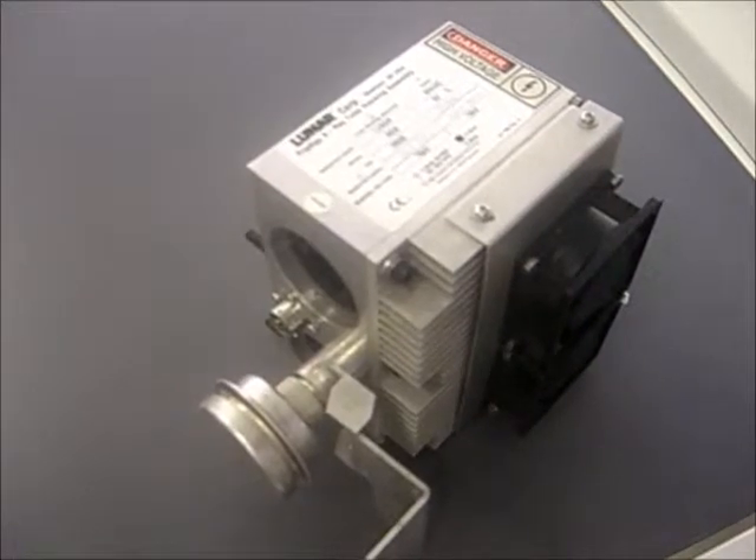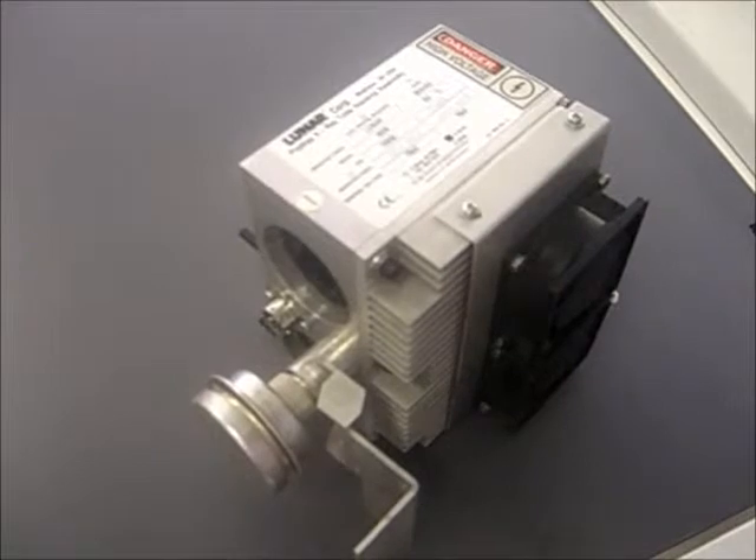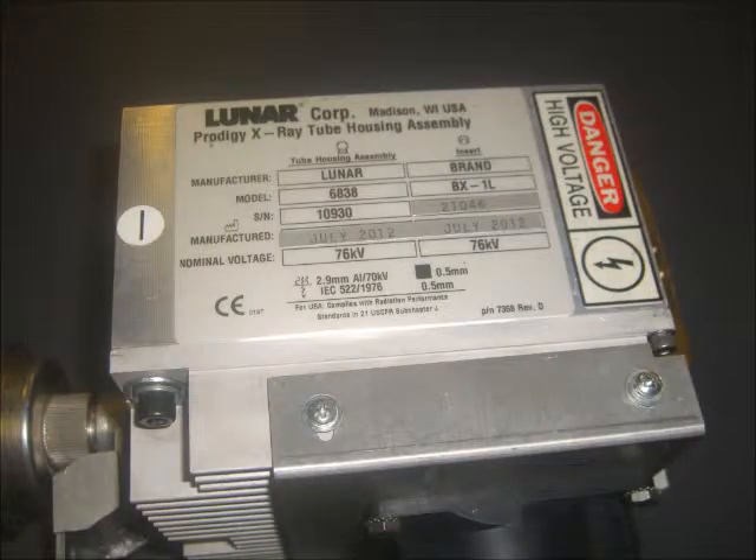The second tube I would like to talk about is the Lunar P1 tube, model number 6838. To find the model number of your tube, please reference the tube ID tag and look in the upper left hand corner.